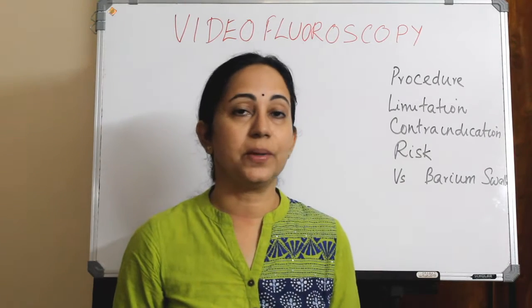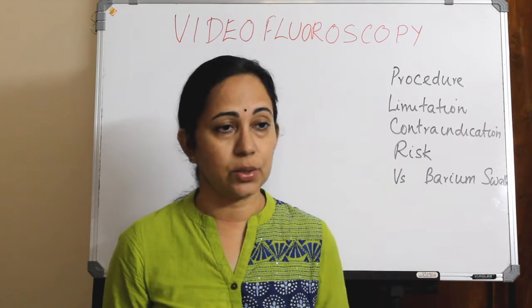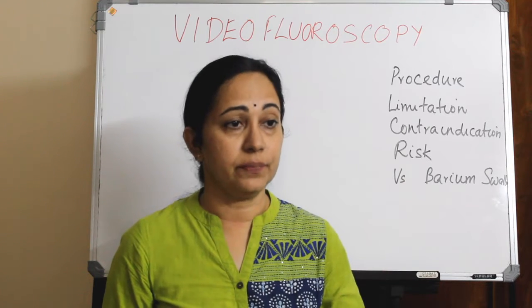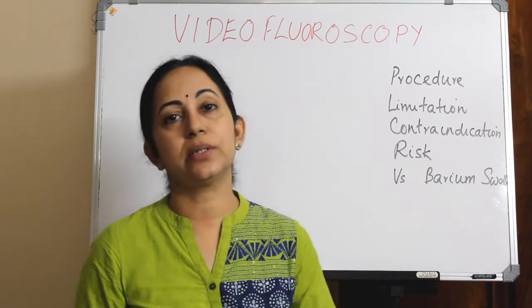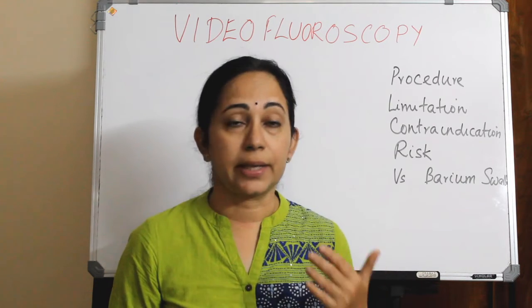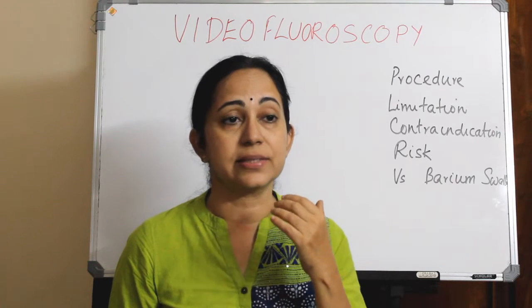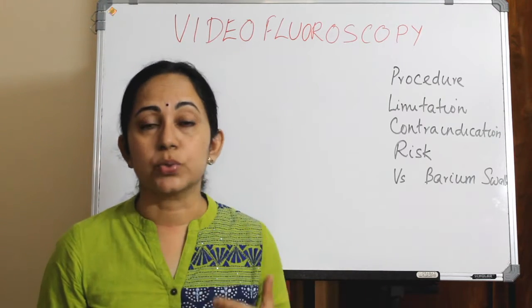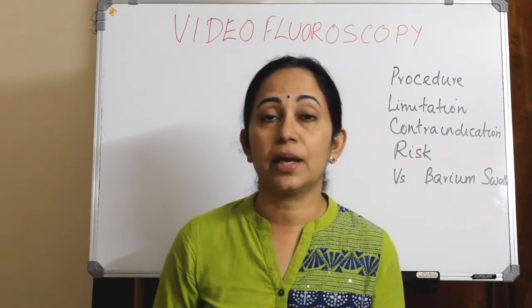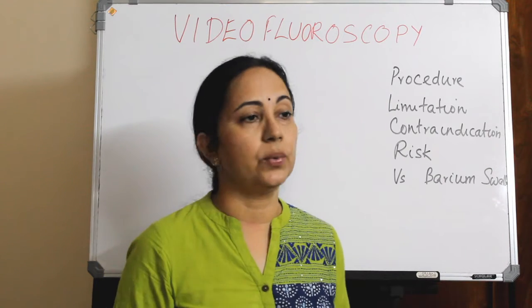This videofluoroscopy is a dynamic fluoroscopic imaging procedure and it shows us all the stages of swallowing. It was described along with the physiology of swallowing, the stages. All those stages can be seen by doing a fluoroscopy, and also the rapid and integrated movement of the oral cavity, the pharynx, larynx, palate, and also the esophagus. All these can be seen. So the anatomical, physiological and structural abnormalities causing dysphagia can be found out by doing a fluoroscopy.